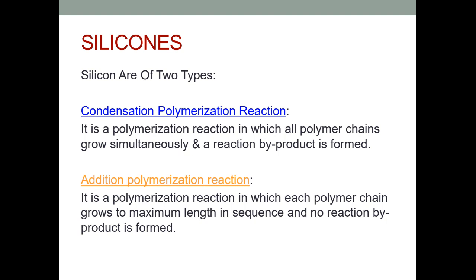In condensation silicone, most of the time we have one catalyst which is the same for mixing the putty, light body or medium body. This is a very clear indication: if a single catalyst is not mixed in equal proportion and is used for all the consistencies, you can understand that it is a condensation silicone material.